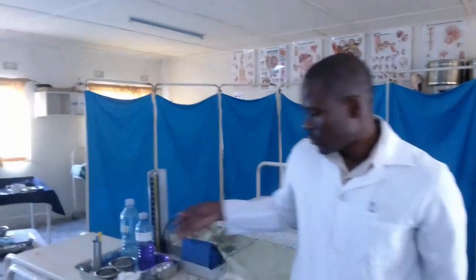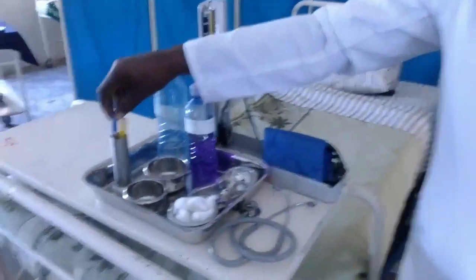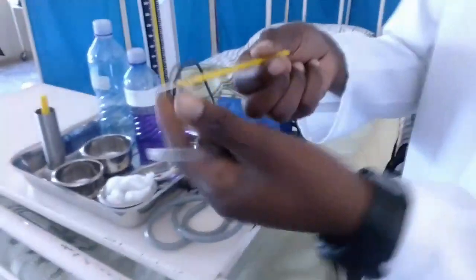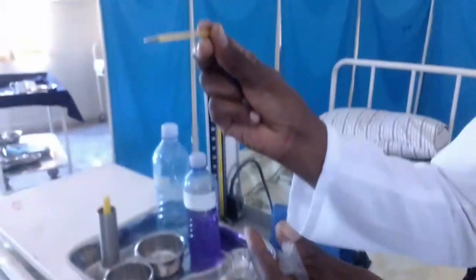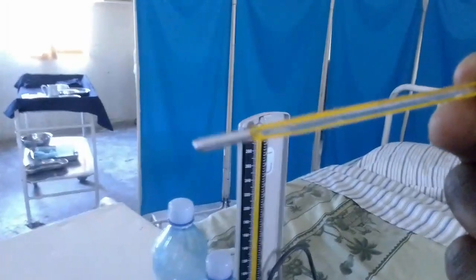Before we do the TPR BP, you need to know that we've got certain instruments that we use. Here with me we've got a thermometer. This is a mercury thermometer, meaning it has mercury inside. This part is shaded so that you use it when you want to visualize. This part has to go on the other end so that you see from here. So this is a mercury thermometer.